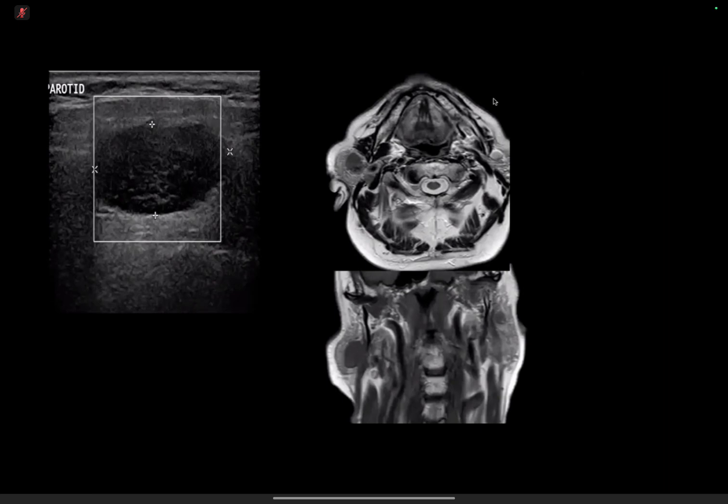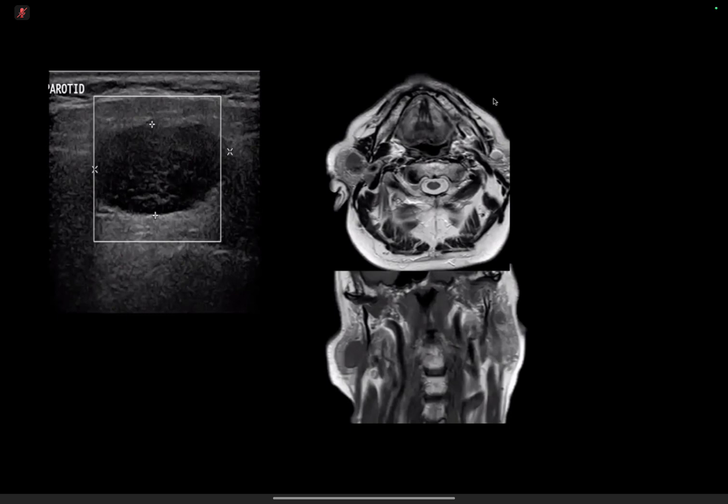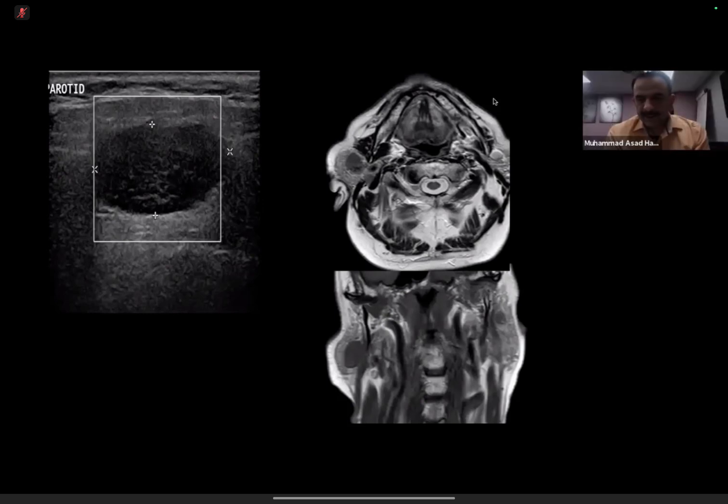I've not personally had much clinical experience with it, but a core biopsy in general offers more tissue for analysis. And given that this lesion doesn't have prominent vascularity, and we can see from the MRI that it's not got flow voids or anything like that, I wouldn't be too worried about hemorrhage risk with the larger needle. So I'd probably offer a core biopsy in this instance.